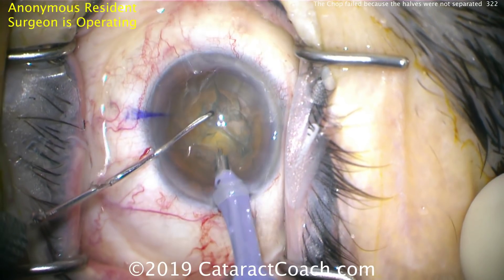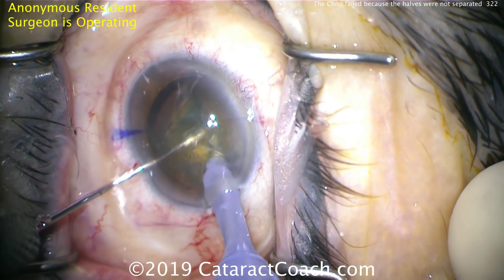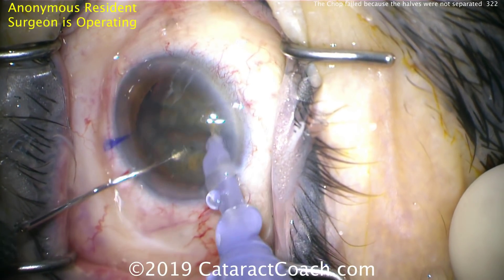There's the FACO probe, good placement, sub-incisionally — beautiful. Chopper goes in, there's the half, but it's still connected. There's not enough of a separation.